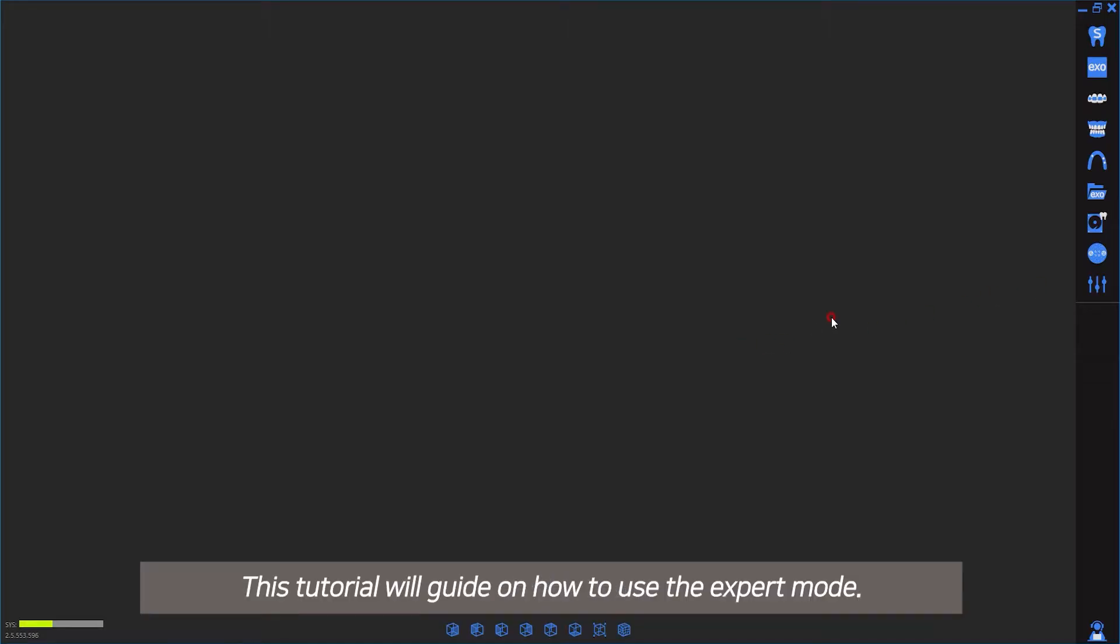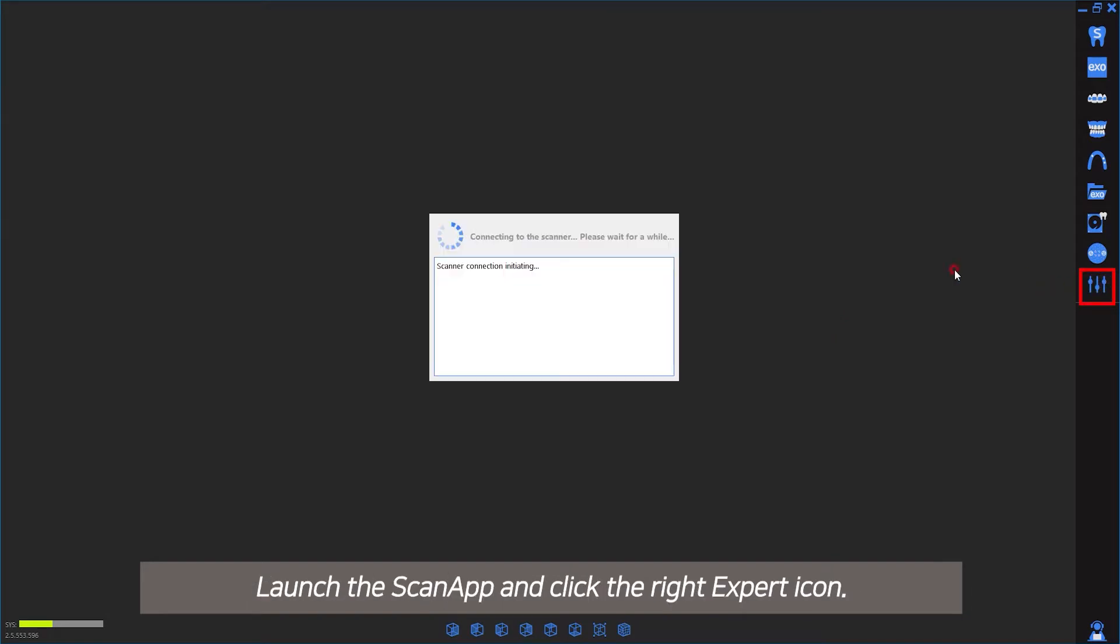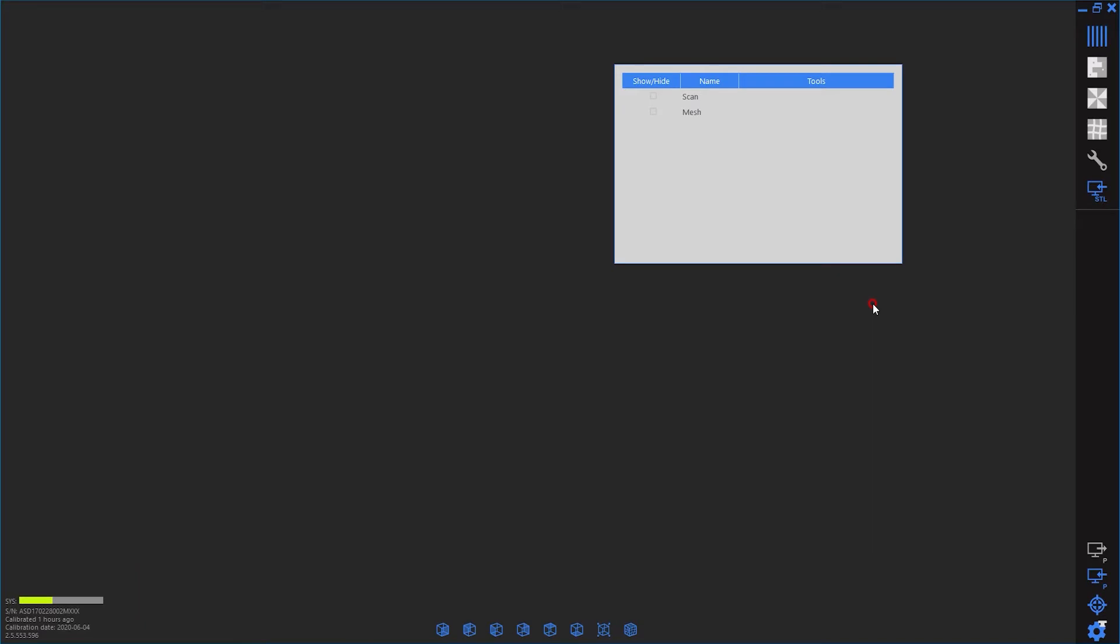Hello. This tutorial will guide you on how to use expert mode. Launch the scan app and click the expert icon on the right. Expert mode has been executed.